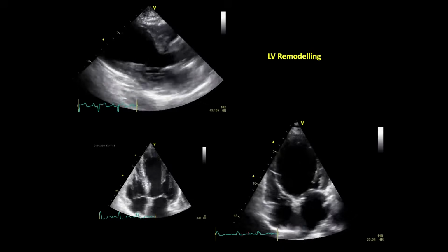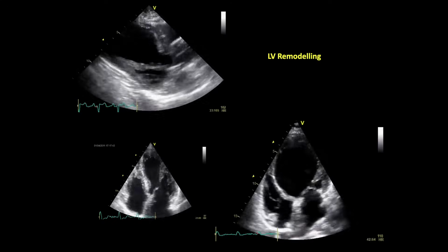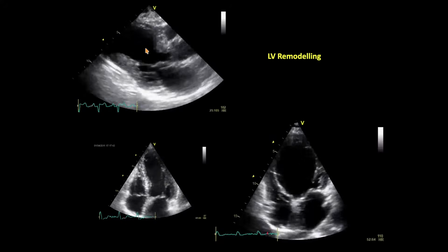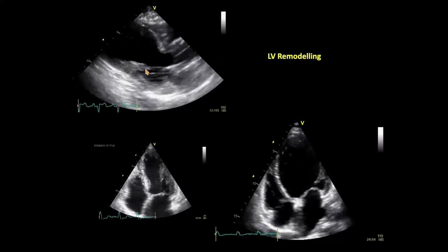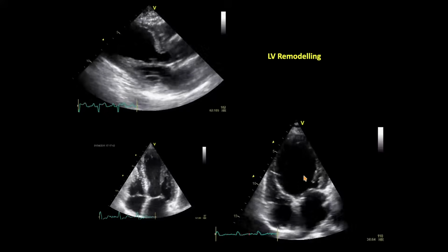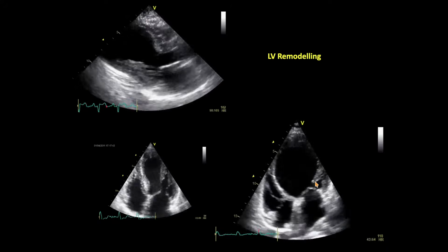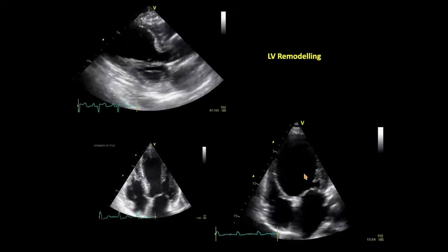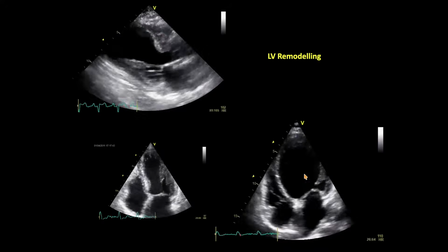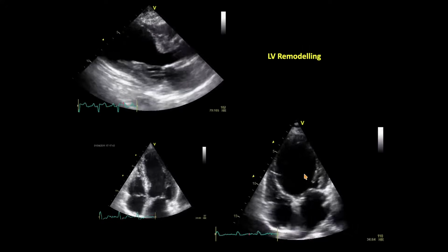And then look at the LV remodeling also. The LV changes its shape in different ways. You can see that the top image shows the LV has got a very funny shape. The short axis has become very wide, so that means it's not a good remodeling. And you can see the one below, there is a dyssynchronous LV, and you have a minor axis almost beginning to equal the long axis, so this is like a globular LV. So if you are sharp enough, you can identify, especially the lower one, a dyssynchronous LV, then the thinning over there, and then the globular shape, that will help.